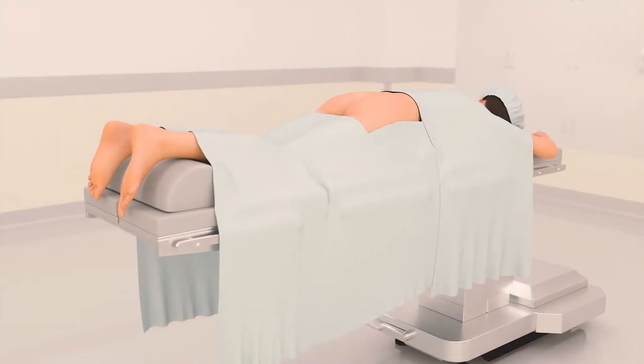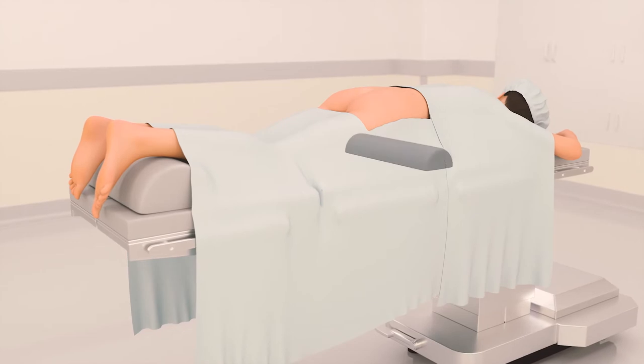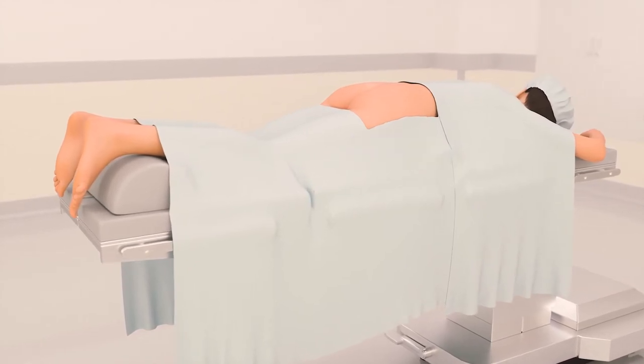The patient should be lying prone with elevation under the hips to allow for a flattening of the sacrum. There should not be any rotation or tilting of the sacral area for ease of needle placement.